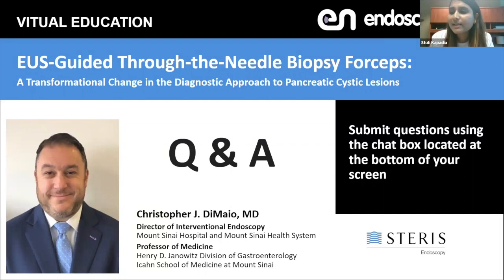What are your techniques when accessing and sampling more challenging parts of the pancreatic anatomy, such as the uncinate process? That's a great question, and that's a very challenging issue. What I've experienced is that for the majority of lesions in the head, when we do a standard FNA, we can access it from the duodenal bulb. The rigidity of the 19-gauge needle can limit that.